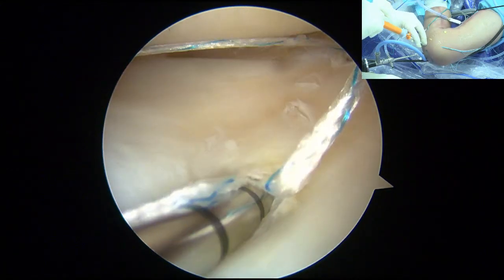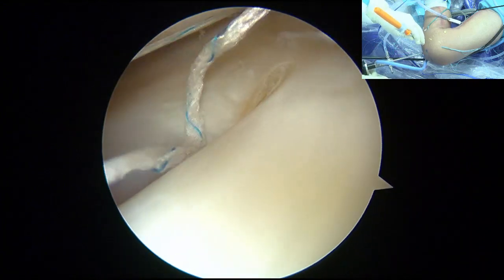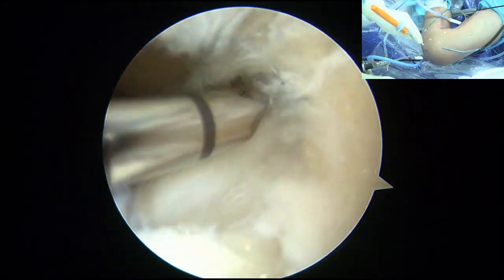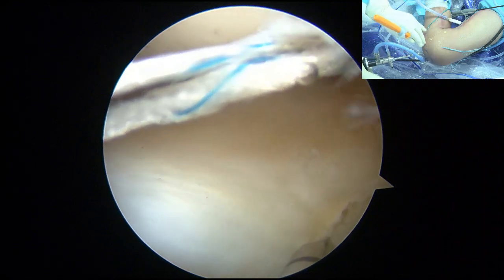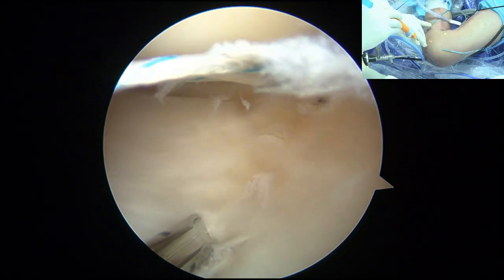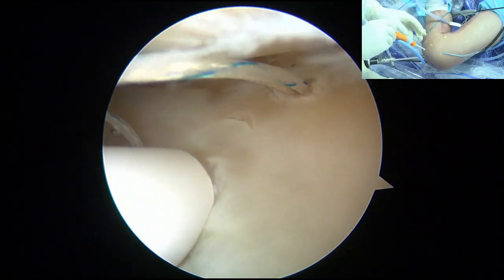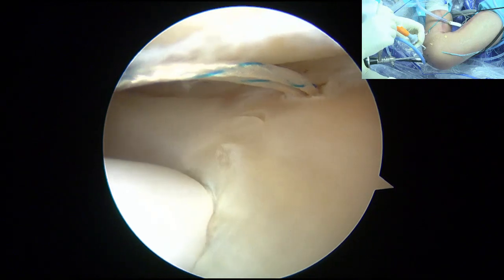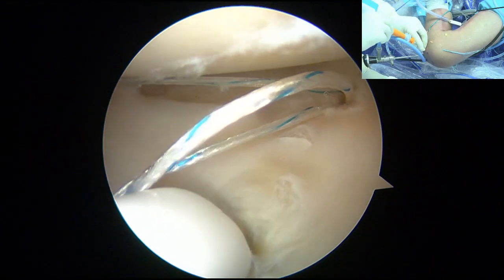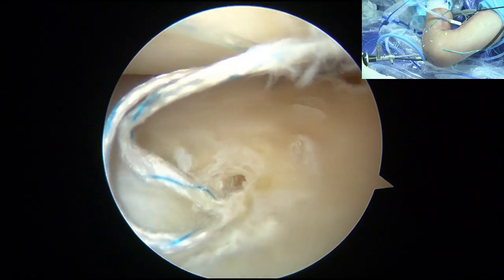Sometimes it's not getting out. Oh no. If the problem is that it bends a little bit, it is not kicking out. So be careful, do not make it bend. The feeling is bad. Getting out? Out. All right, it's out now, right?